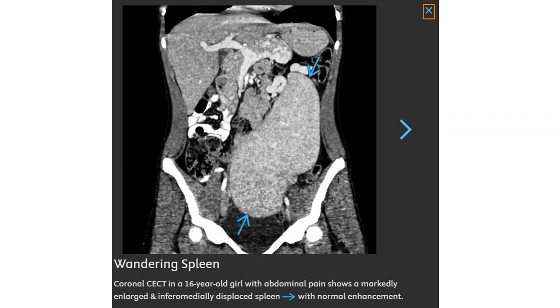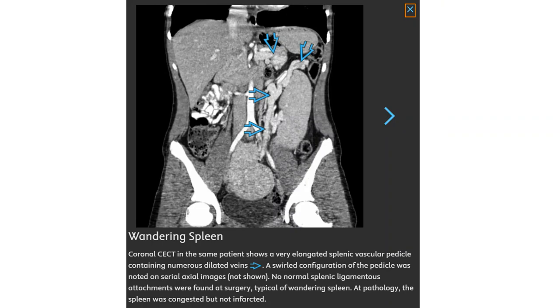This is a contrast-enhanced CT in a 16-year-old girl with abdominal pain, showing a markedly enlarged spleen with inferior and medial displacement, but with normal enhancement. A very elongated splenic vascular pedicle contains numerous dilated veins. A swirling configuration of the pedicle was noted on axial images. No normal splenic ligamentous attachments were found at surgery, typical of wandering spleen. The spleen was congested but not infarcted.